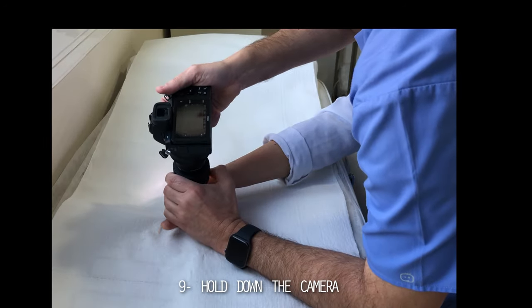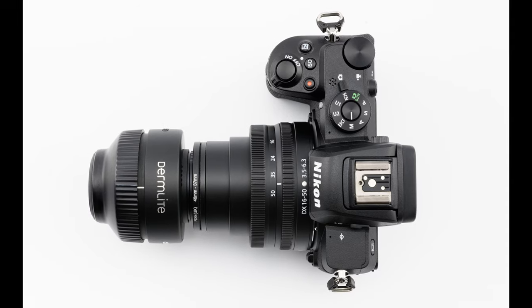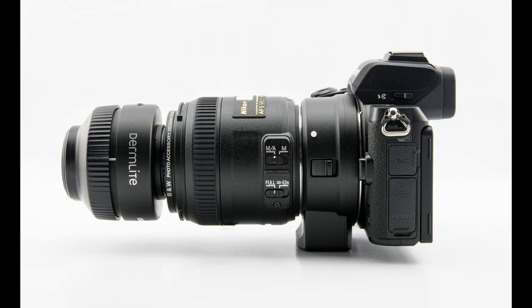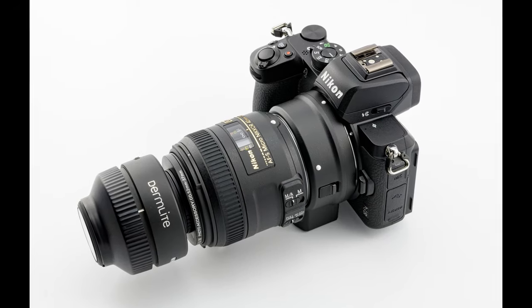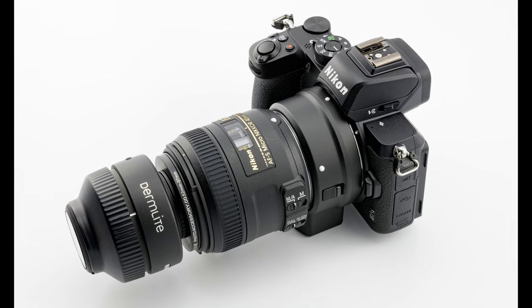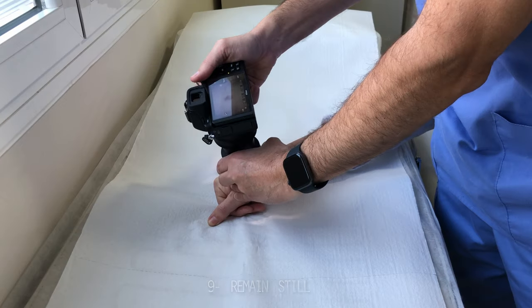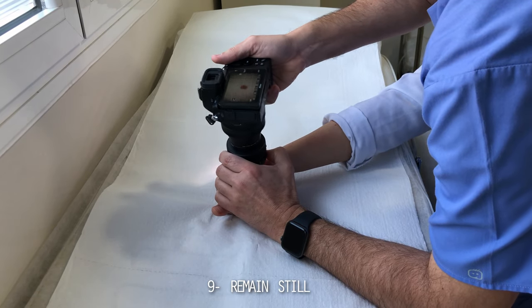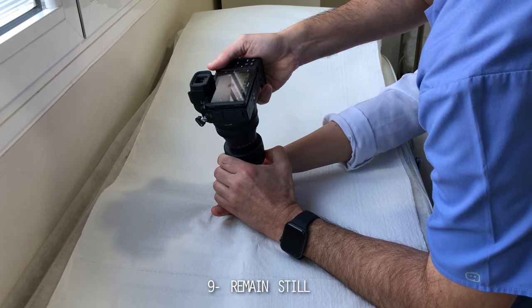Another important piece of advice is to firmly hold the camera, especially if you are using a proper camera instead of a mobile device. Whether you take pictures with a compact, mirrorless, or a reflex camera with the dermatoscope attached, it is likely that the lenses included have a longer focal distance with higher magnification ratios, and therefore motion blur is more likely. Use your forearms or elbows to secure your position against the couch or table or whatever surrounding surface you have available, and ensure that the gear is held down securely and won't move from the skin underneath.